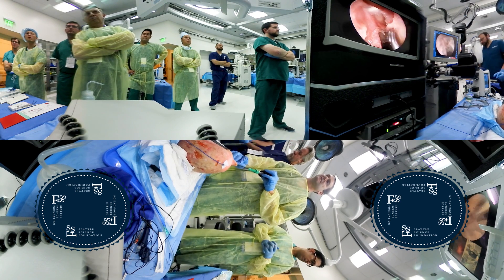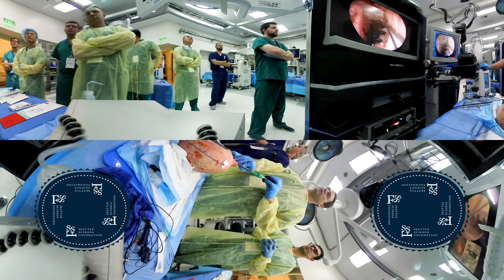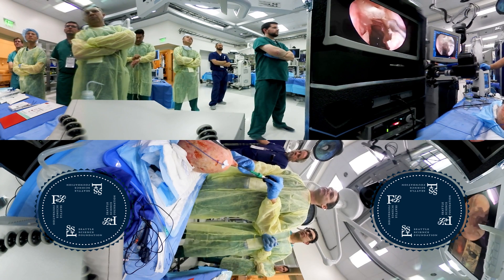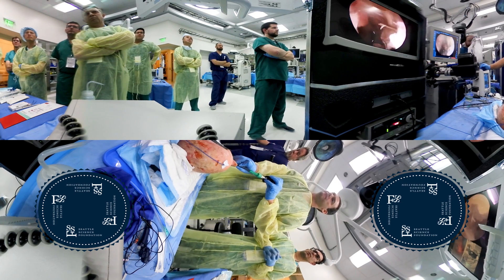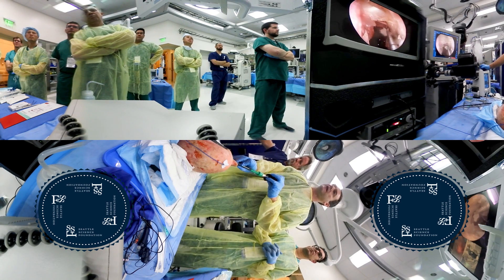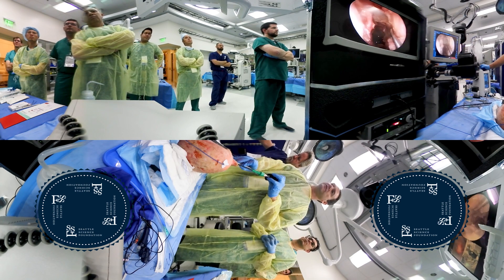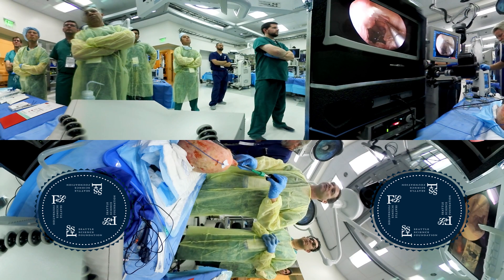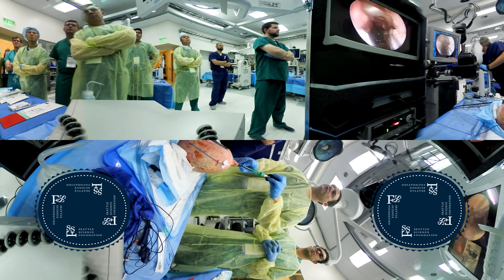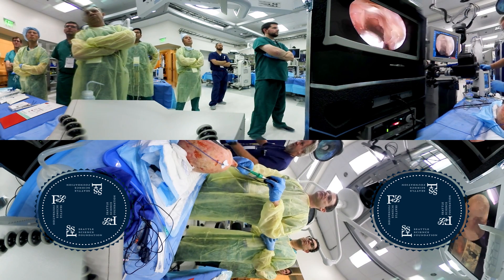Once you start to get that periorbit, if you do go through it, the fat will herniate. We're going to take this all the way back — I may not do it today because I want to get you guys operating. A suction freer is fantastic. We're going to avoid that artery up top — there's a little posterior ethmoid there. If you continue in this natural trajectory going up towards skull base, that's not where we want to go. The apex of the orbit is down here, right above the roof of the maxillary sinus. You always have to remind yourself: stay low, stay low, stay low to get back into this part.